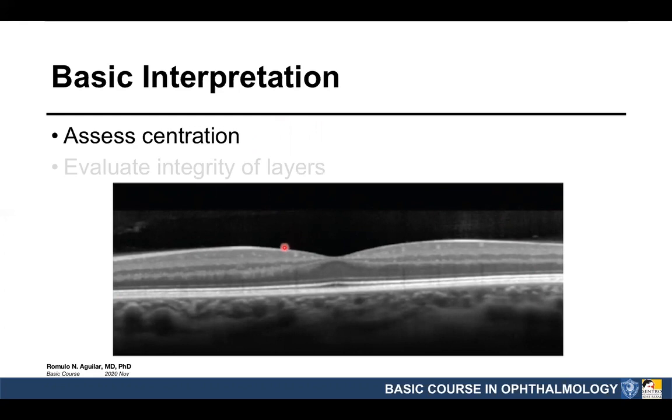You always look for this shape, the foveal depression, and not only that, you look at this tapered shape here, there, and this one, because you know that there are certain layers of the retina that are lost as you approach the fovea. So there is tapering. To emphasize, there.